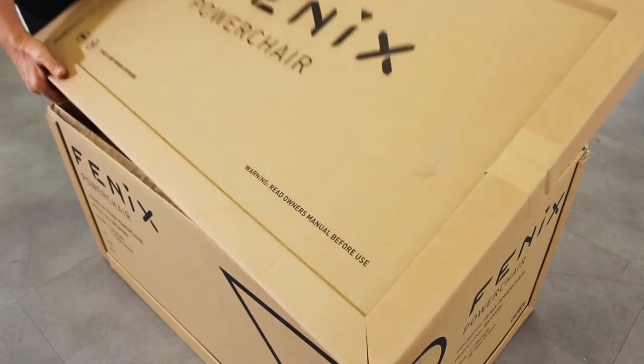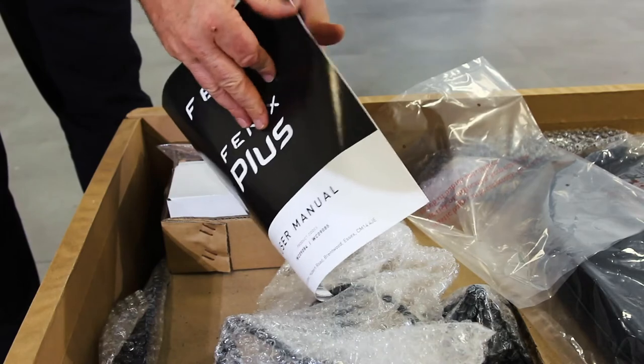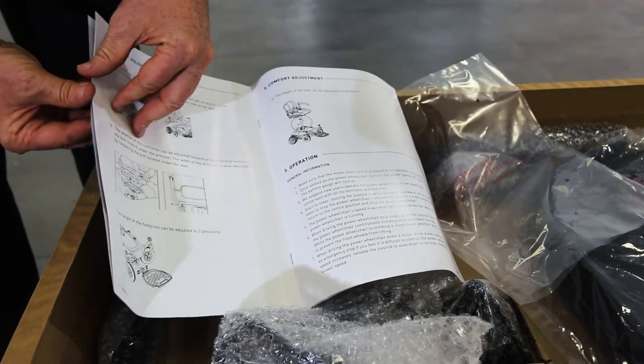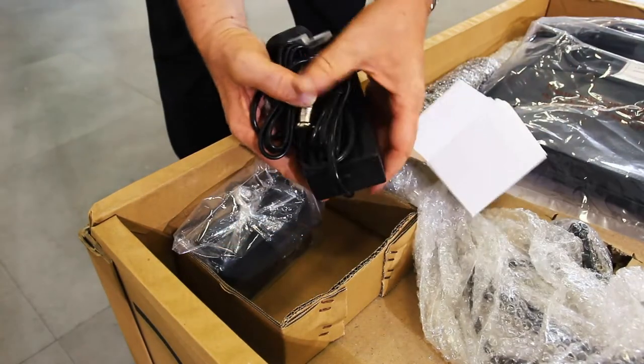Lift off the lid and set it aside. Inside you will find the instruction manual. Please keep hold of this as it contains useful information about how best to use and maintain your chair. You'll also find a charger for your power chair's battery.